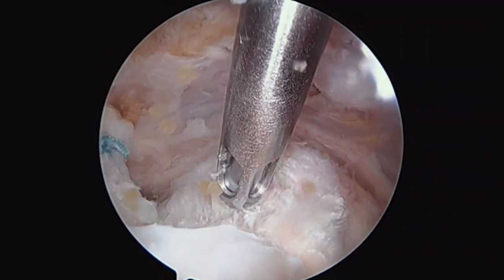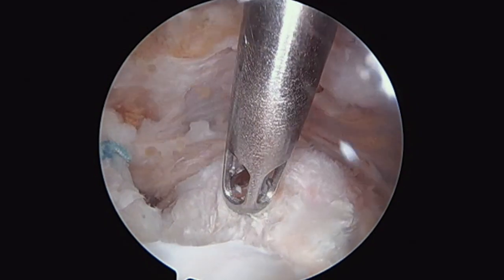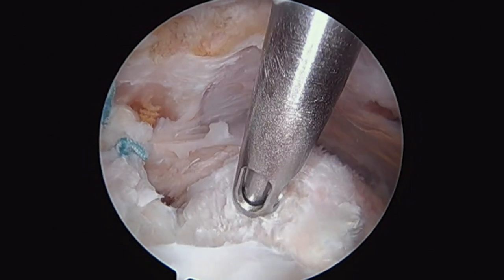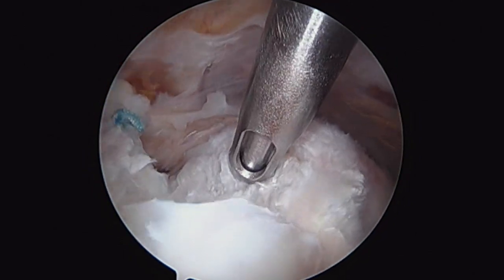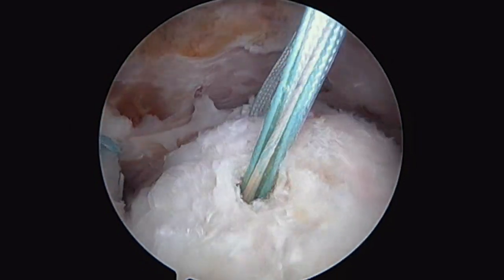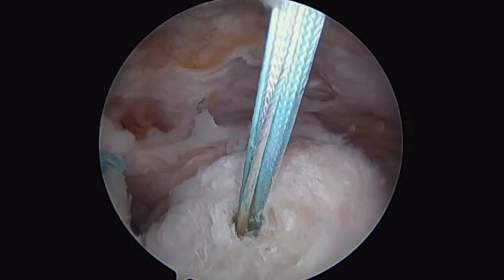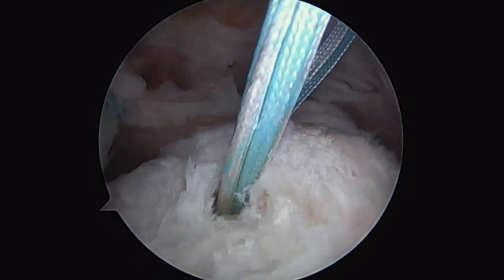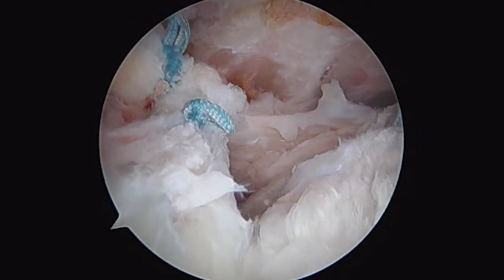This is how we drill our anchors. This is the guide, that's the drill going in, and this is the anchor going into place. You can sort of hear it there. Here's it coming out and there you can see the anchor. I'm going to give that a tug and you can really see how strong that is. We've got two anchors here — one's more anterior over there, and this is our posterior anchor that's going to allow us to fix the cuff now.